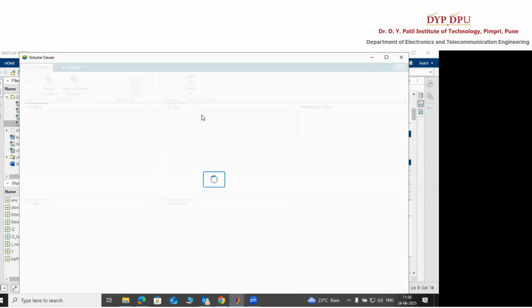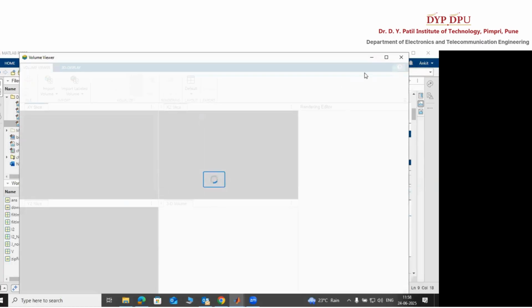I have shared very well written code, so you will get a very good understanding, even when you switch to the downloaded MATLAB version.